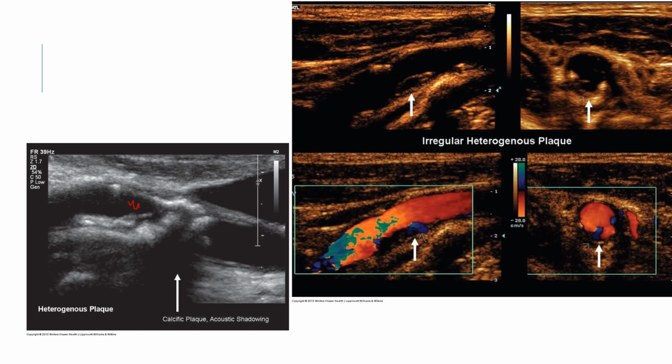Now, here you can see how you can even use your regular color Doppler over the top of these different B mode maps, and you don't have any issues with that. This indication here, this line pointing here, would indicate there's actually a hemorrhage in this plaque, meaning it's much more dangerous than maybe just a fibrous cap plaque.